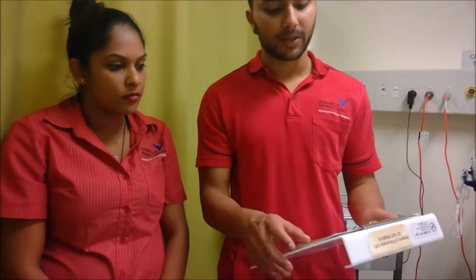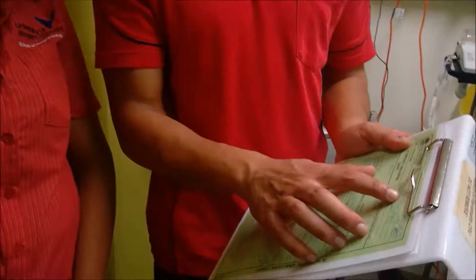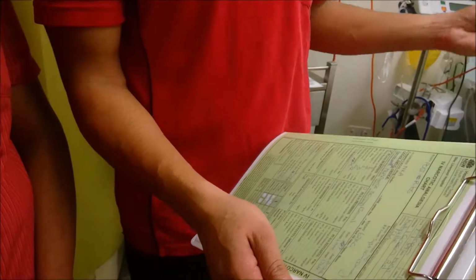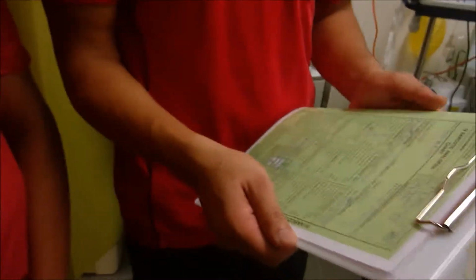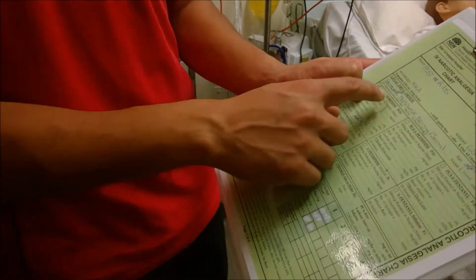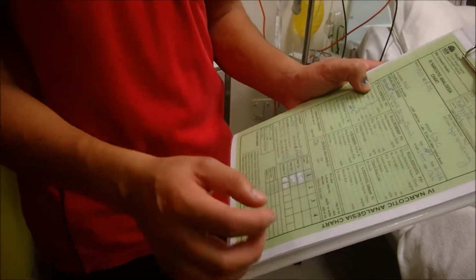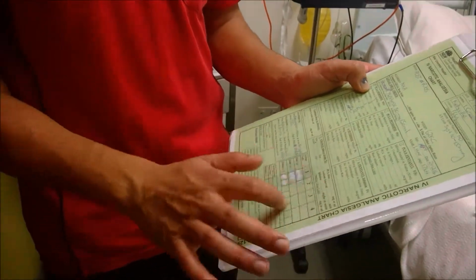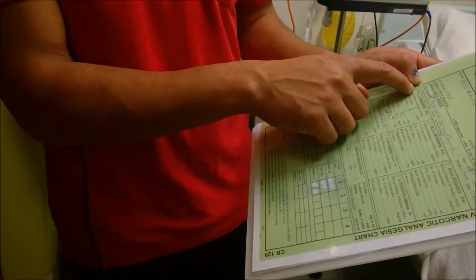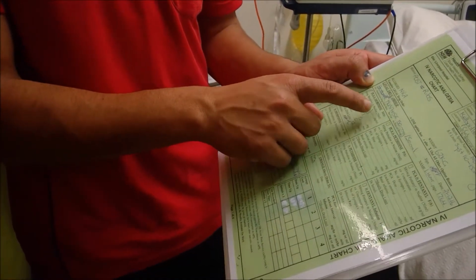Thank you. So we need to confirm the order, validate the order. We have Mariam Adib, 7th of the 1st, 1969, 174963. She's lying in bed right now. She has no known allergies. We've checked her ID and it all matches. The doctor signed an order for morphine, 50 milligrams in 50 mils. It's been signed but hasn't been given yet. It's an IV narcotic. We'll be putting it through a PCA. The concentration is 1 milligram in 1 mil.